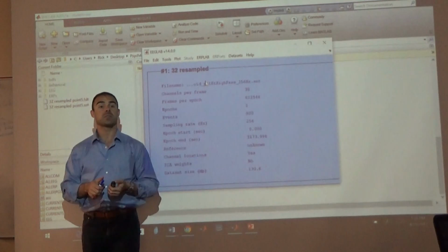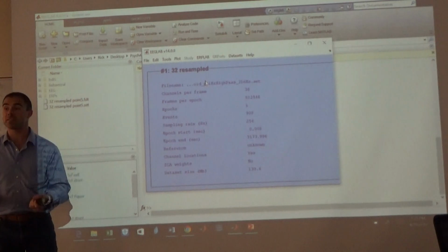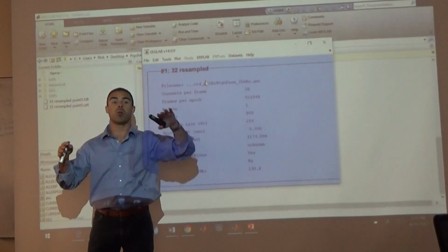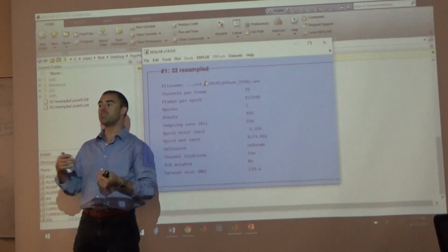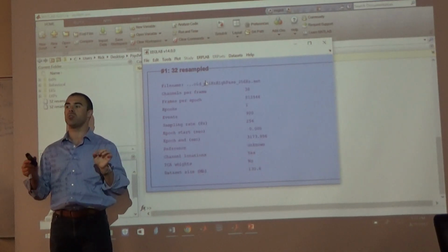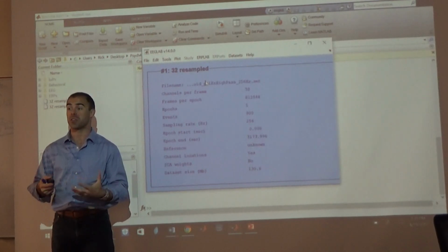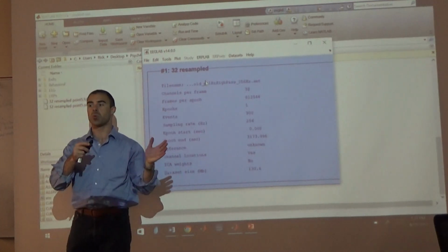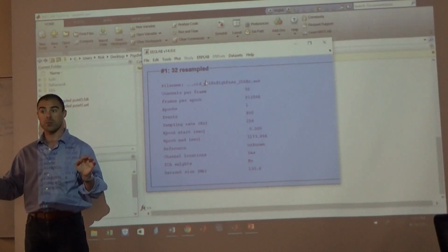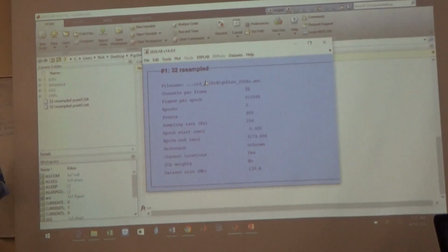So we're going through all these steps because, at least for some of the early ones, we know that there were artifacts in the data, right? We know that there's drift from a long period of recording, right? So we apply our high-pass filter. We did these things because we're trying to get the data in the way that we need it in order to make sense of the brain activity to resolve our hypotheses. So we have to do all these pre-processing steps. Sound good? Everybody on board? Awesome. You guys are doing really good. Isn't it a lot easier when all the computers work?